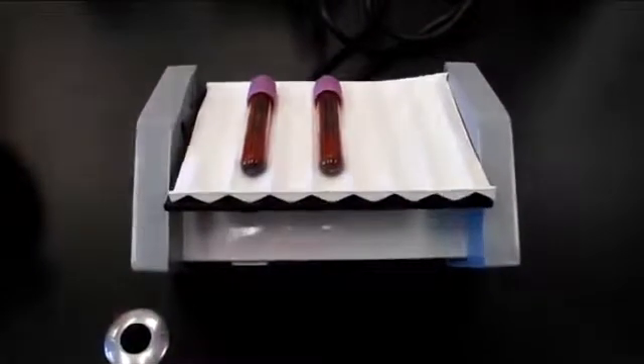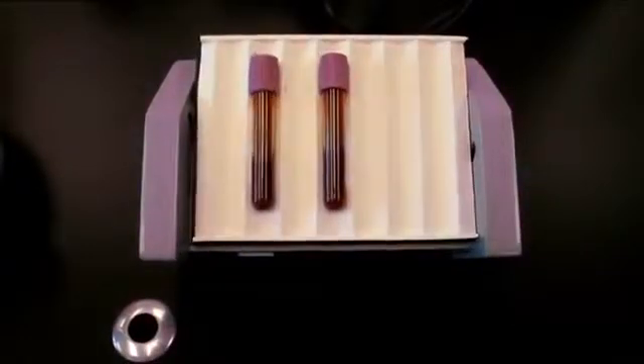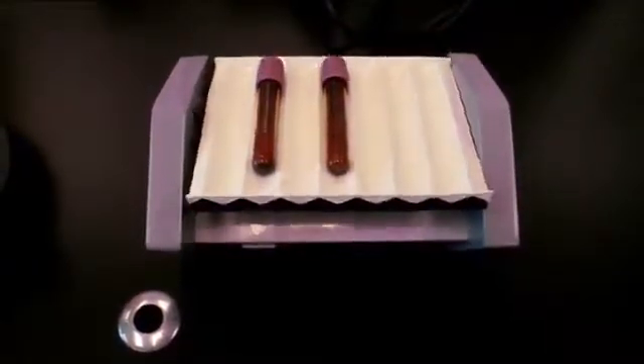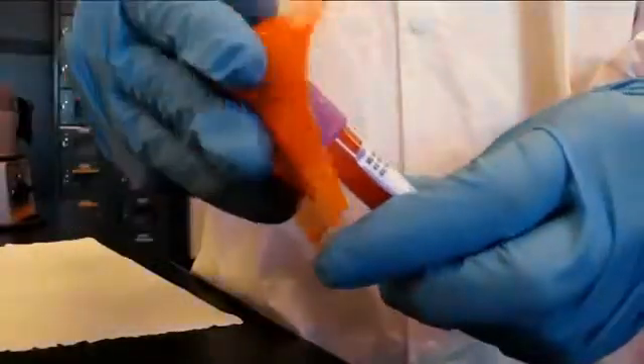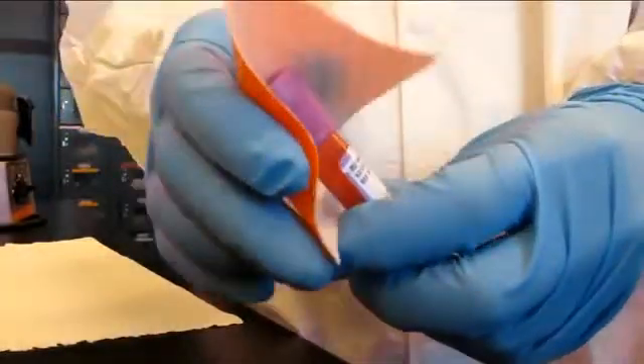Begin by obtaining a well-mixed sample of EDTA whole blood at room temperature. This may be done by placing the lavender top on a rocker. For safety, use an absorbent pad to remove the cap off the whole blood.